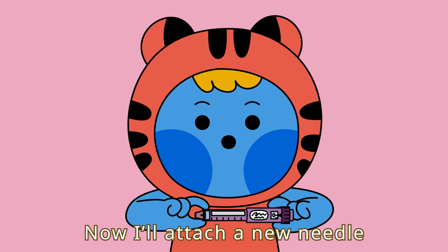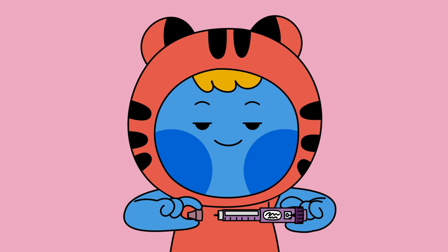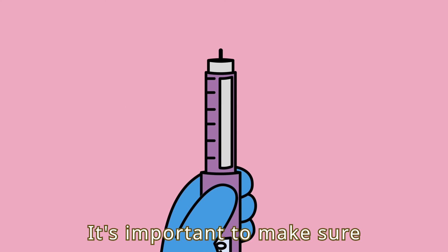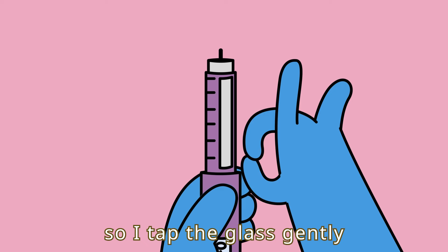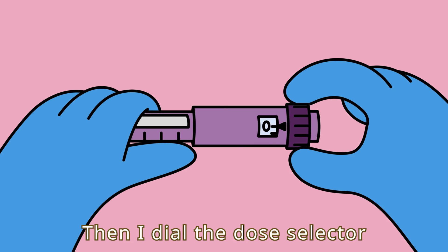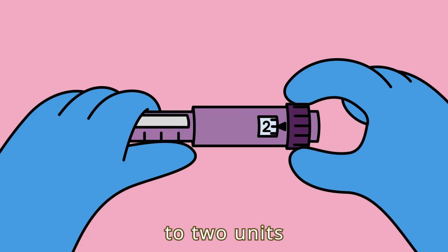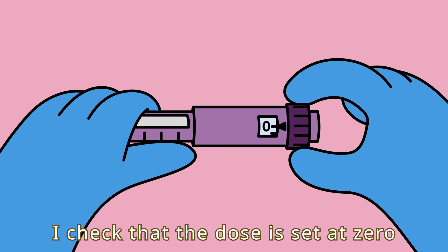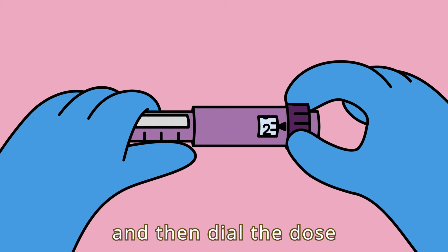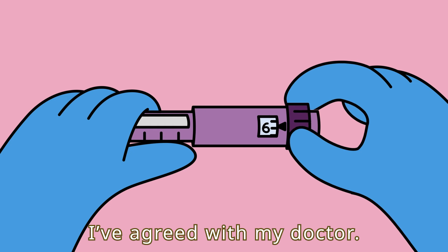Now, I'll attach a new needle to the pen. It's important to make sure there is no air in the pen, so I tap the glass gently with my finger a few times. Then, I dial the dose selector to two units and push the air out. I check that the dose is set at zero and then dial the dose I've agreed with my doctor.